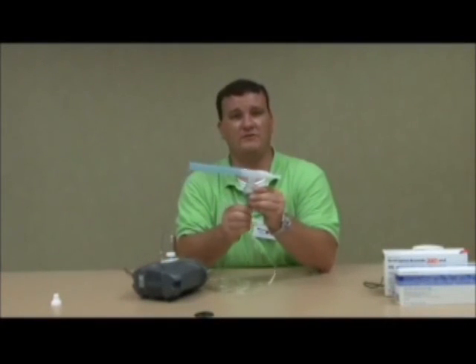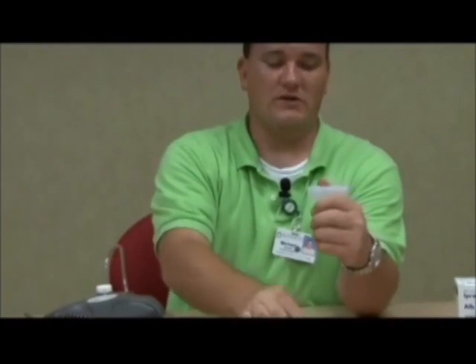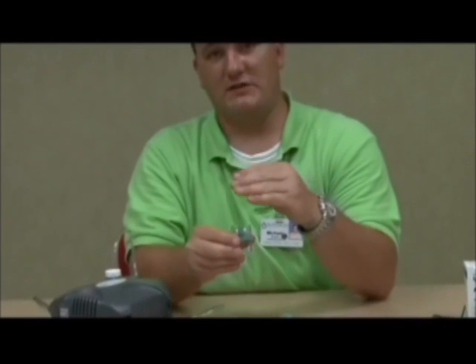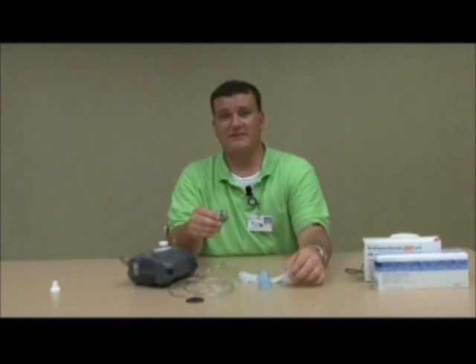Once your treatment is through, you will need to take your micro-mist kit to the sink and clean it. First, detach the tubing on the bottom. Leave it connected to your compressor — the tubing will not need to be washed. Take your kit completely apart. It's very important that you rinse out or clean your nebulizer kit after each treatment. You can do this with warm water after each treatment, but for the very last treatment of the day, clean it in mild dish soap and warm water, let it completely air dry, and replace your nebulizer kit at least every thirty days.